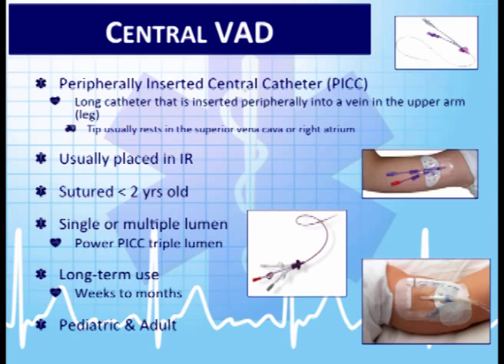Some facilities still suture them in adults. Others will just use that securement device. And it could be a single or multiple lumen. So an example of that, I'll pass these around.